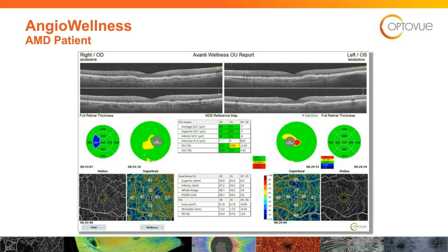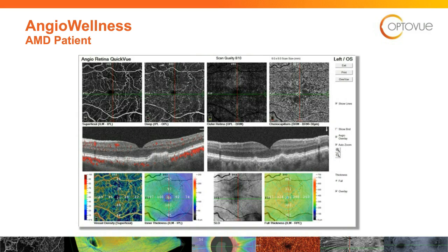You can't really tell that there's any choroidal neovascular membrane just by looking at those. We go to the individual B scan, and if you look at this middle scan below the superficial and deep, where those drusenoid changes are, you can see that there's no blood flow activity, so there's really no activity down there. Again, it's a little more advanced, getting to learn how to interpret them.